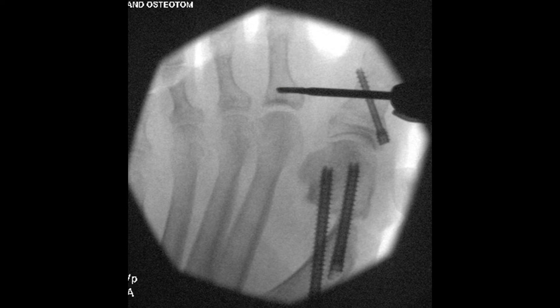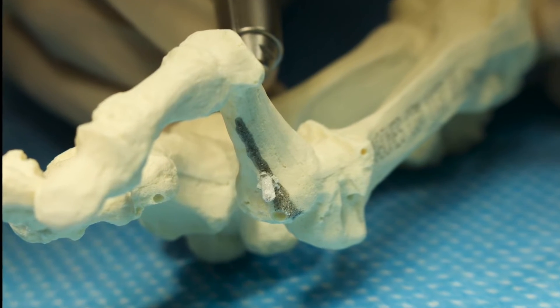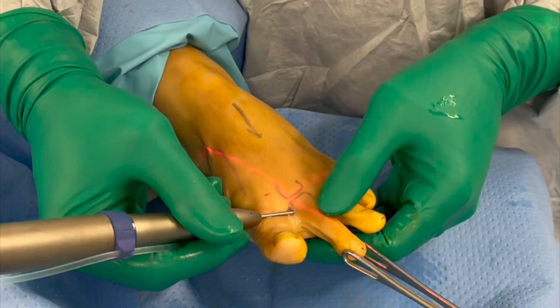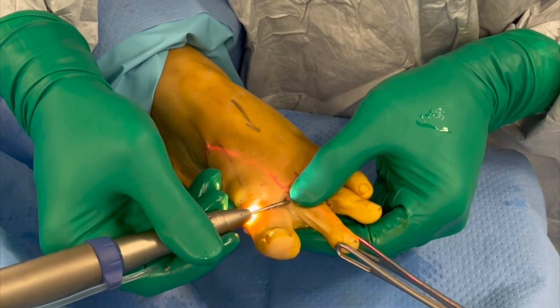The burr is inserted through the near or dorsomedial cortex but does not perforate to the far lateral cortex. The burr position is checked on the image intensifier. The dorsomedial cortex is cut from inside to out, with the thumb of the opposite hand helping with the feedback when the burr cuts through the dorsomedial cortex.